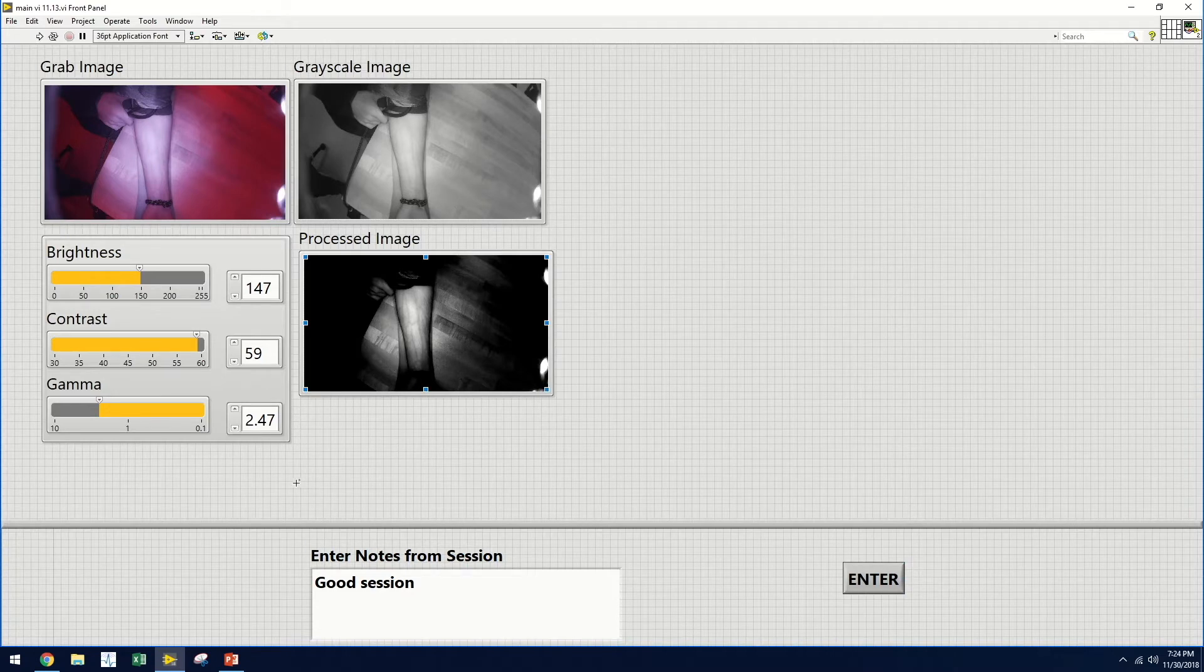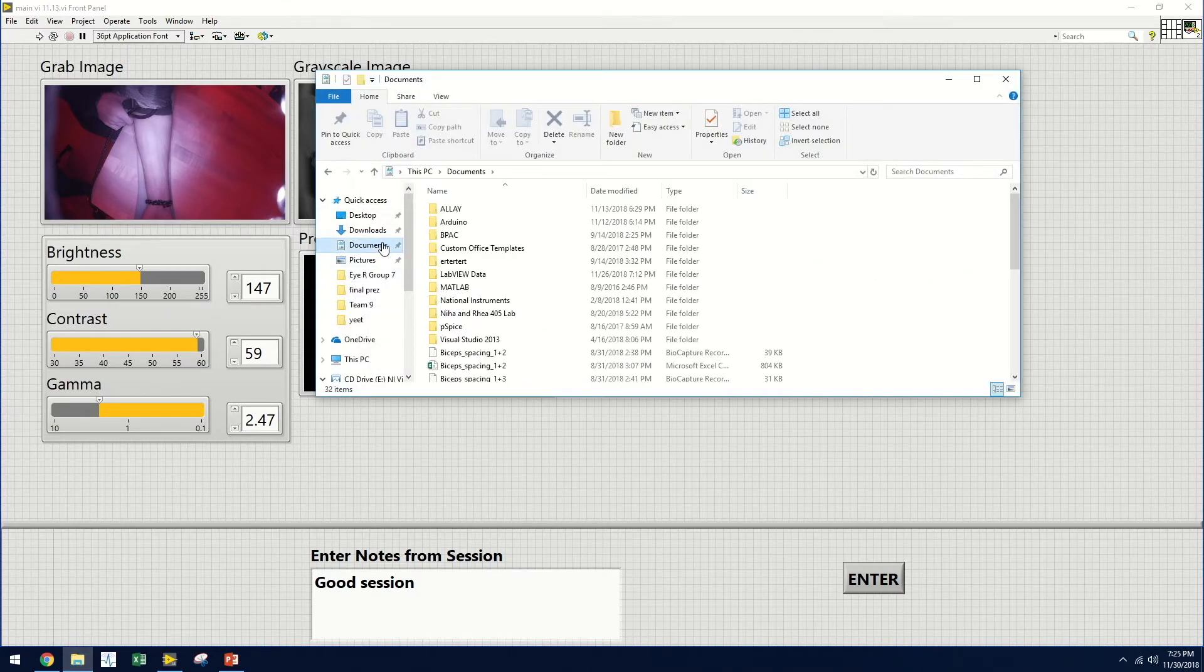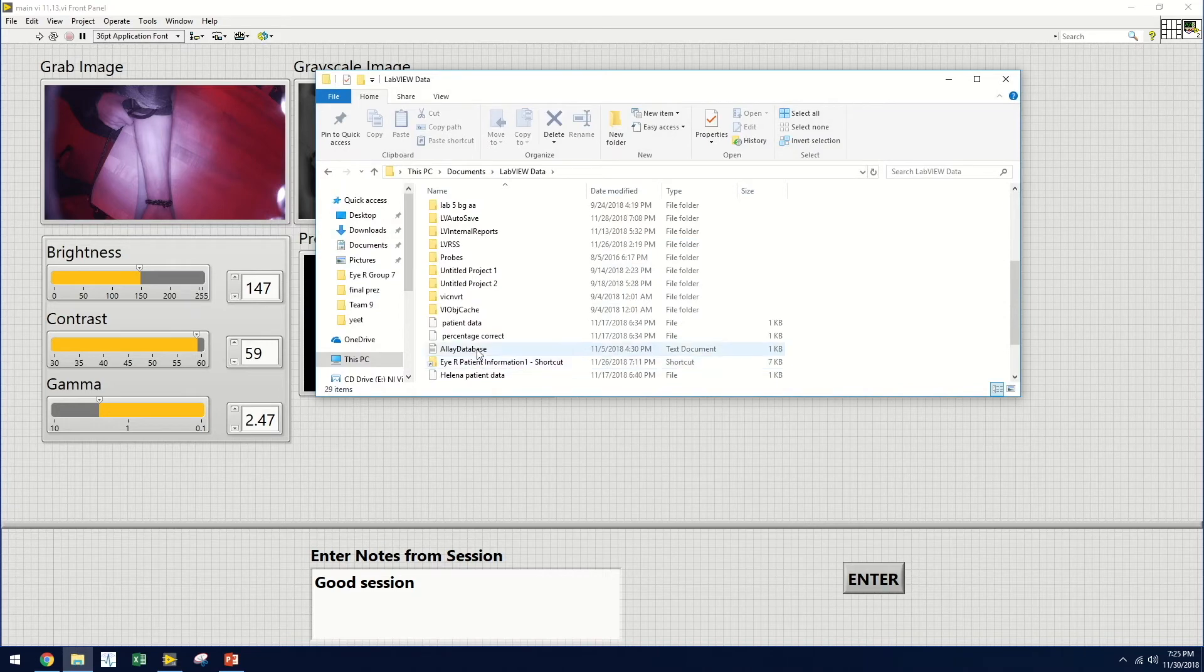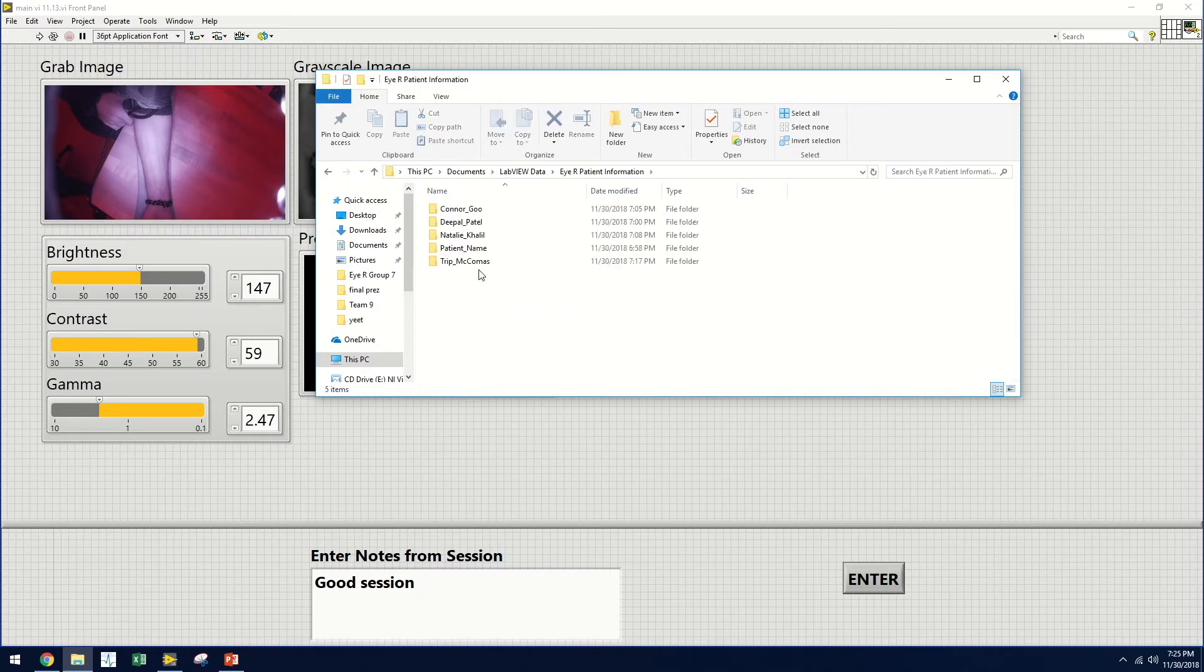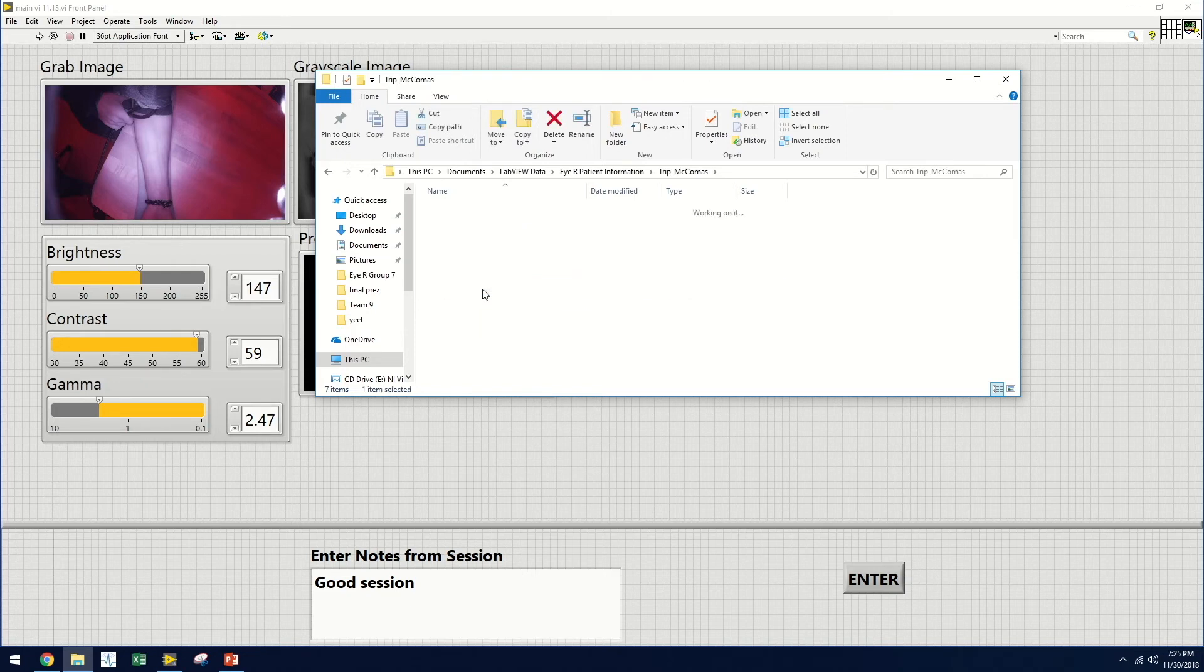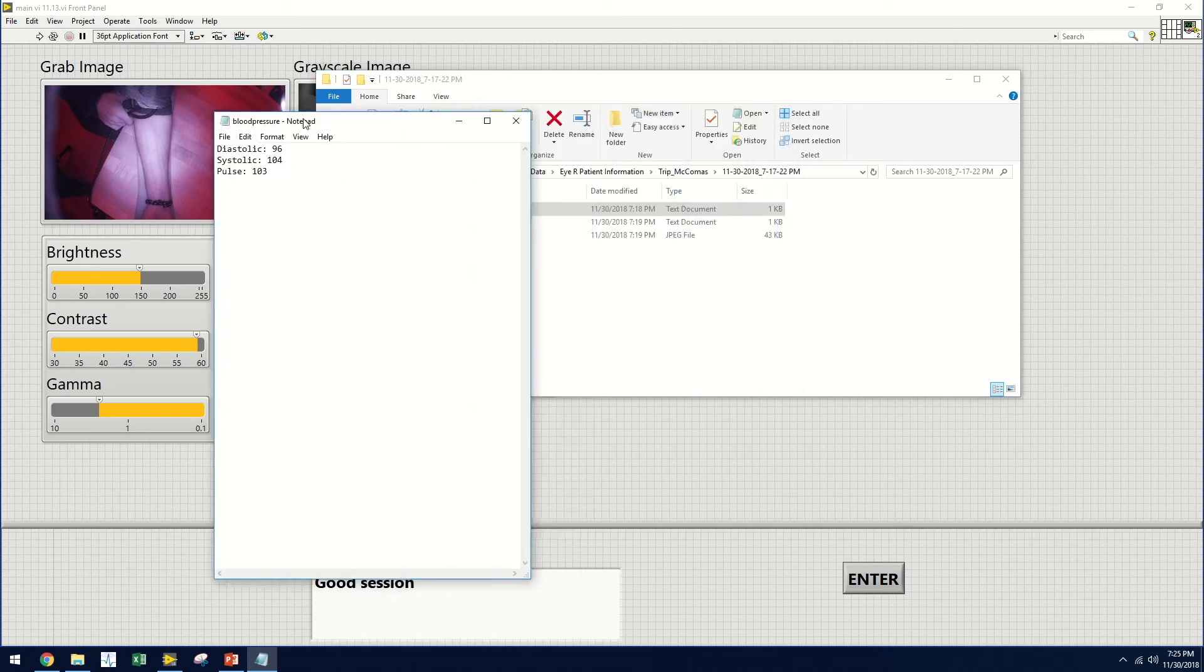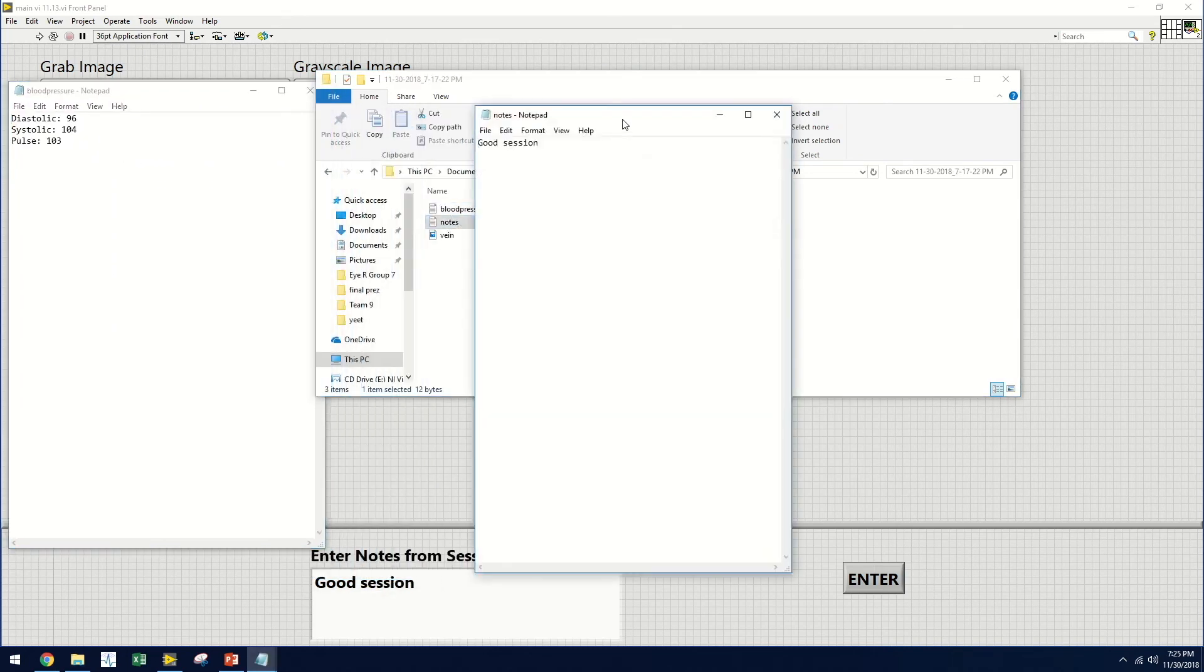So now let's take a look at the patient profiles. We will access LabVIEW's default data directory, and select a folder called IR Patient Information. This will show us all of the patient profiles. We will select the correct patient, and the correct day and time of the visit. And within this folder, we will see files for blood pressure, the notes from the session, and the successful vein image.